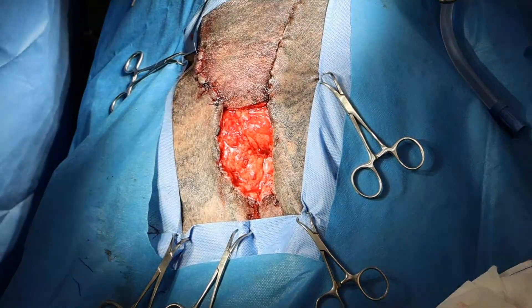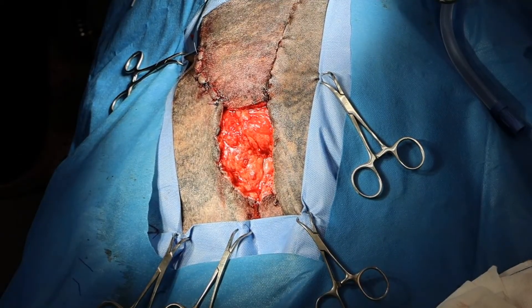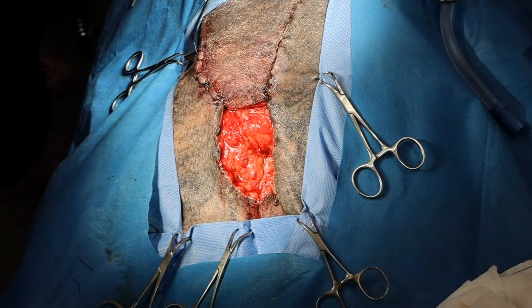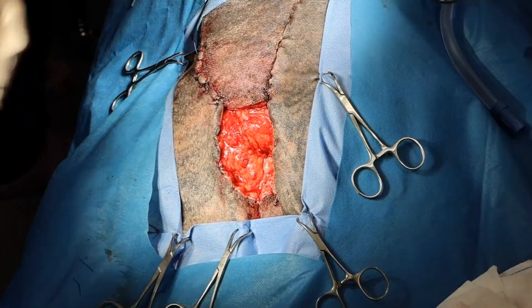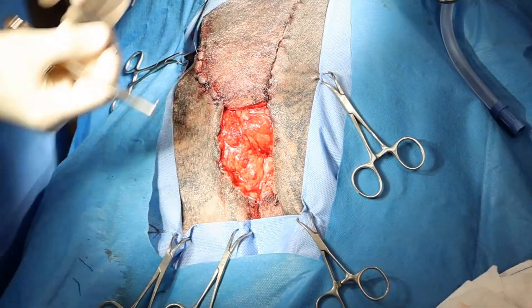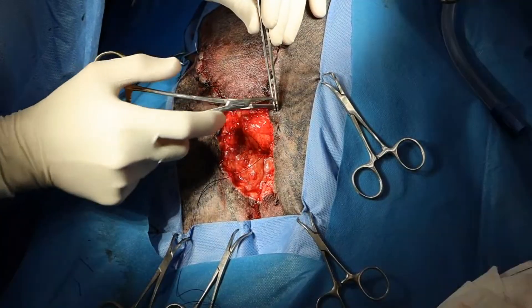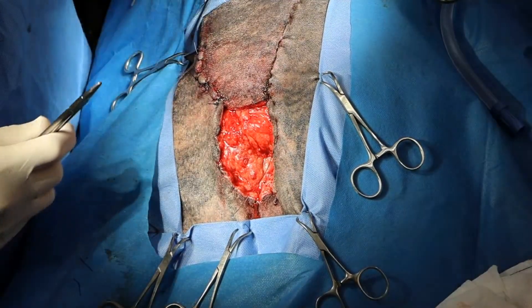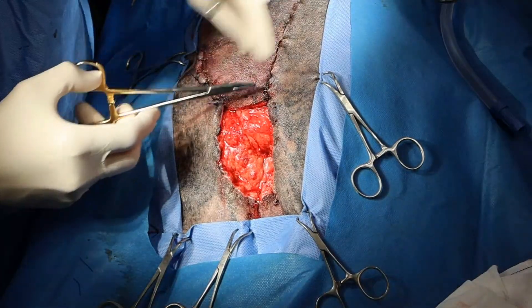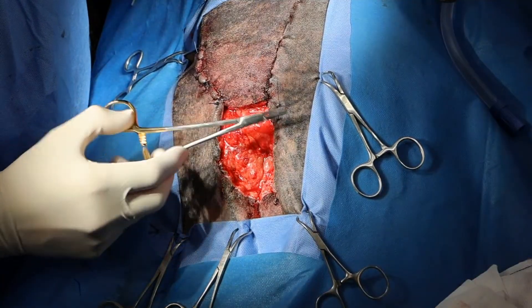Hi guys, this is Charles. I'm one of the surgeons at the Animal Emergency Center in Moorabbin, which is a suburb of Melbourne. I was previously live streaming a revision or debridement of a failed advancement flap. I did the laser therapy on one of our viewers' suggestion, which I think is actually a great application of laser. So we've done the laser and now we're back, and I'm placing my loops for my tie-over bandage.